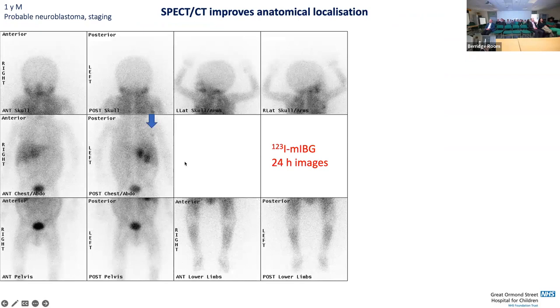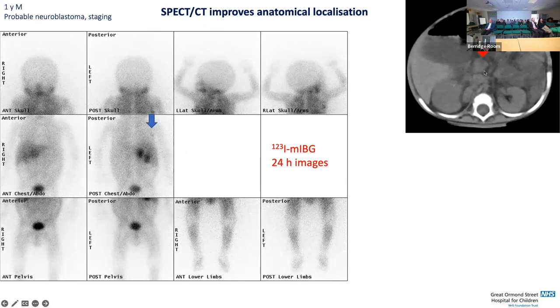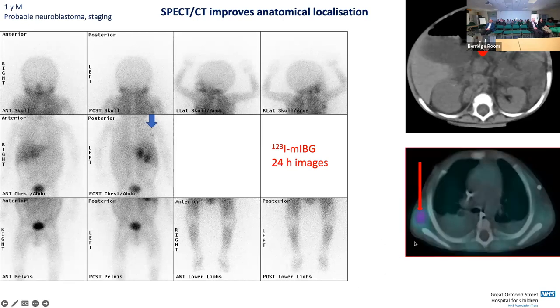And this is another case. You can see here primary neuroblastoma in the right suprarenal region, this area, and no great uptake in the subcarinal or axilla, nothing of any significance clearly. There was also this lymphadenopathy, non-avid, in the abdomen there. And this area of avidity was a lymph node which was resected and proven to be ganglioneuroblastoma intermixed on pathology.